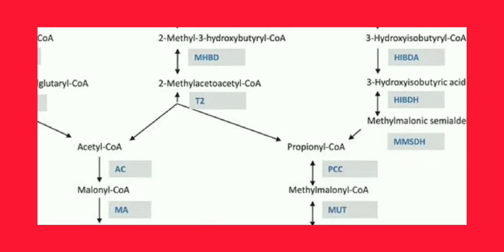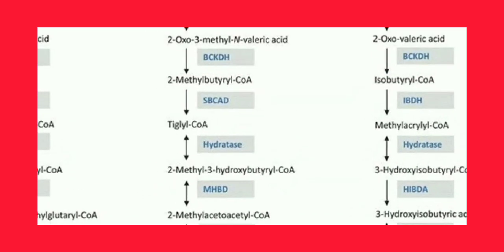You can see the screen, right, where it is showing leucine, isoleucine, and valine. These are the amino acids. In any metabolism, there should be a precursor, right? That is where the metabolism starts. So I can say that the leucine metabolism includes whatever analytes are given with the arrow marks here. These are the organic compounds or the intermediates of the pathway.